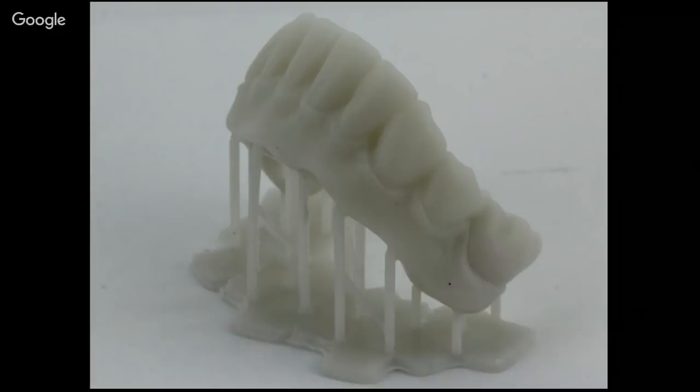So right now, if you go download the beta, you're going to see that the only physical denture teeth we have available right now are the nobilium teeth, and we've only got 3 molds in particular of those nobilium teeth. Now, I know everybody's got their favorite pet brand of teeth. The Mondial teeth are nice. There's many, many nice denture teeth, and I know everyone wants to be able to use their preferred method.